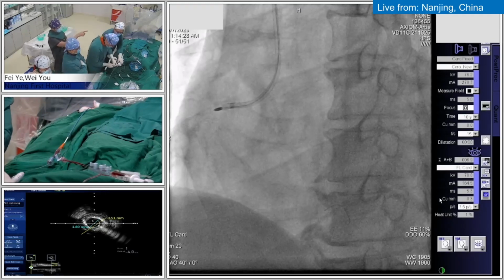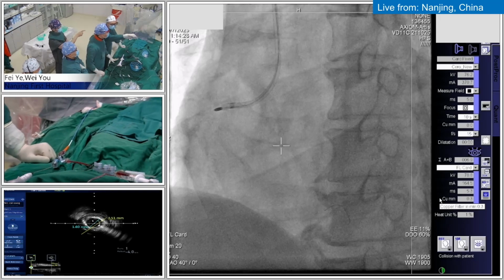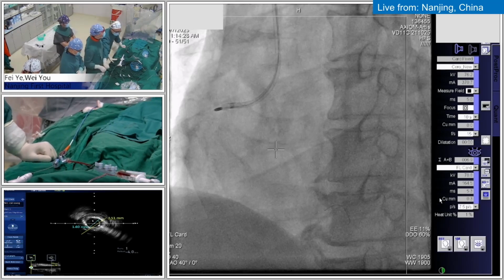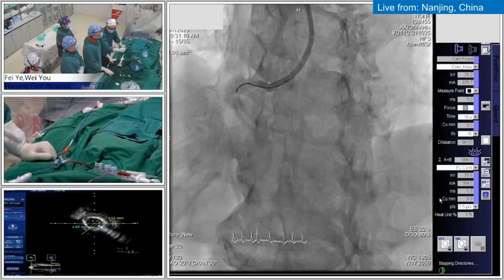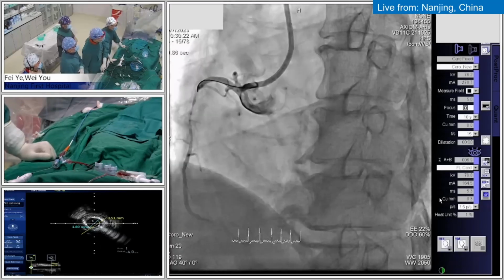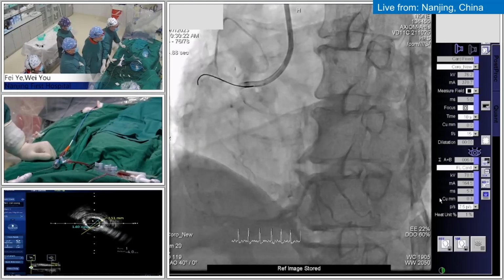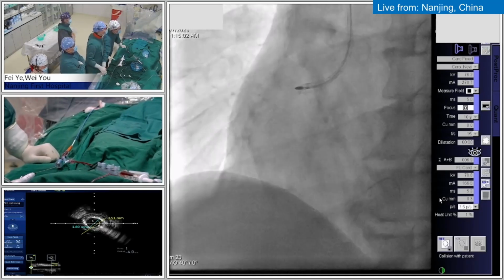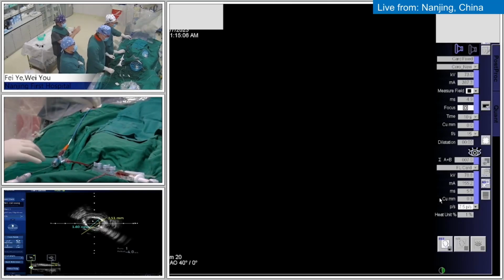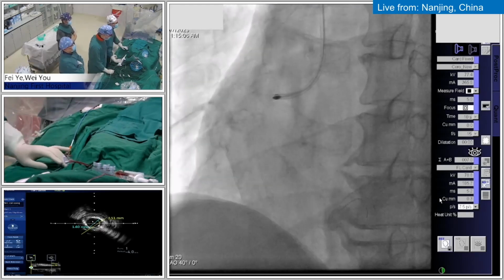Use the RCA angio, please give us the first angio. Zoom there. Frozen previously. Yes, this one. Give us a better, clearer view. You may make sure of the rota distance from here to there. Yes. So we will start.